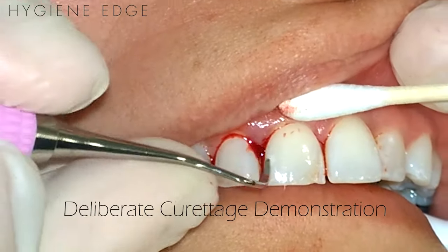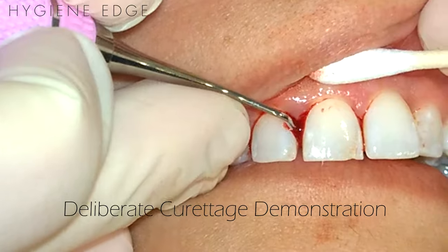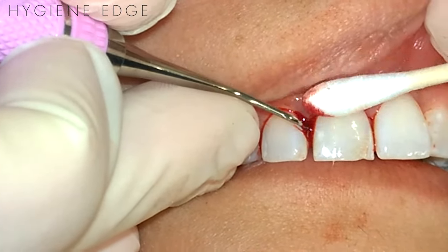For the procedure you'll need a sharp instrument and a cotton swab. Take the cutting end of the instrument — I'm using a Barnhart 5-6 here — and place it at the base of the junctional epithelium towards the wall of the sulcus.